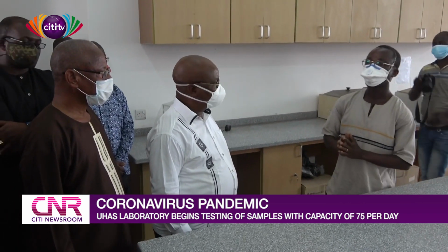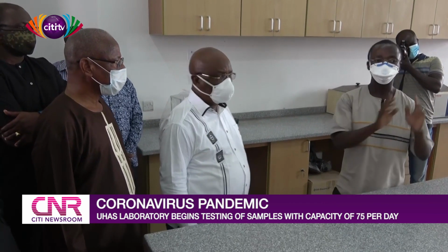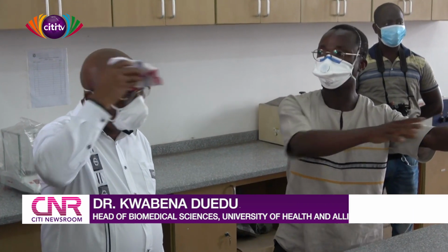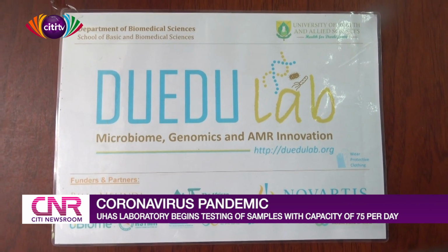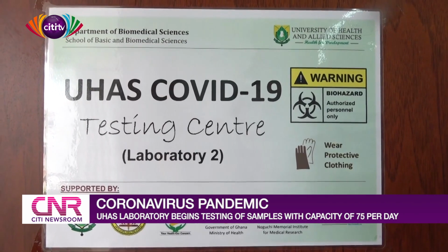Some of the challenges that we have in laboratory diagnosis is accompanying information. So it's very critical that we have adequate information on the sample before we even test. Because when we test and you don't have adequate information, the test is useless. So we make sure that we do that on this middle bench.